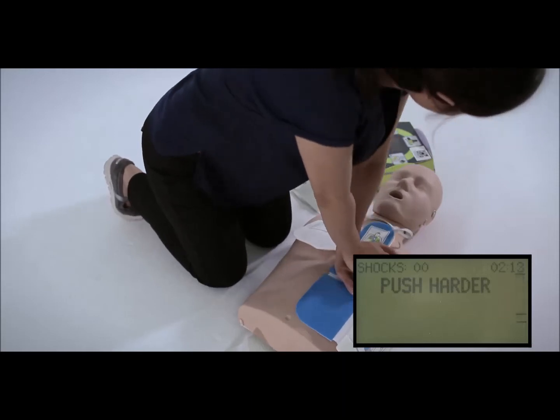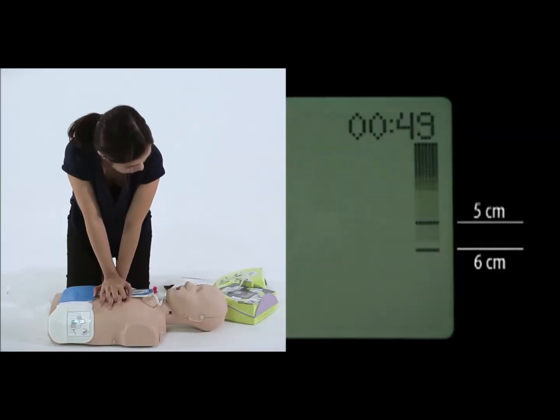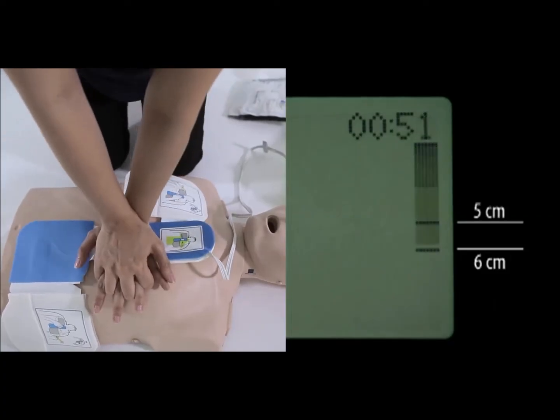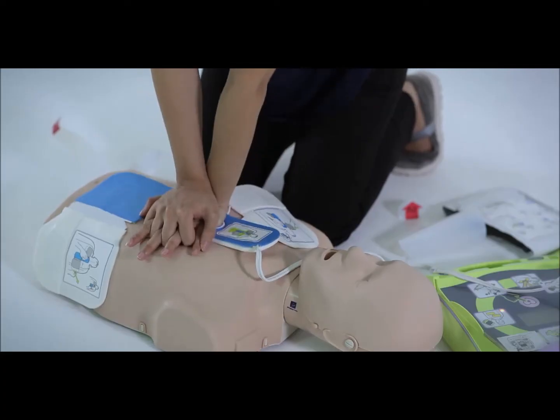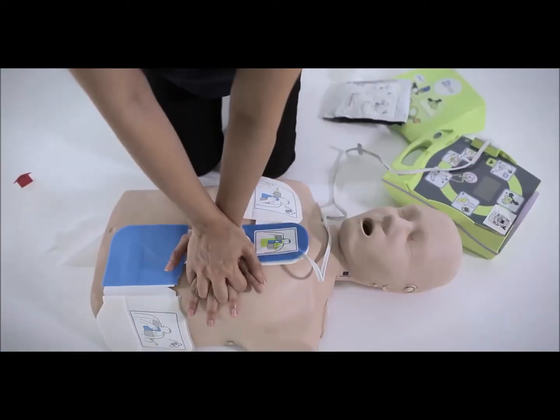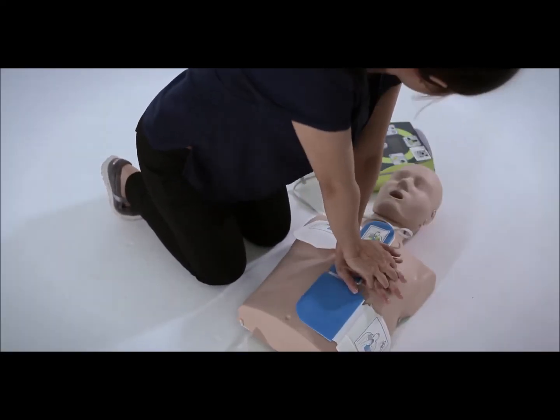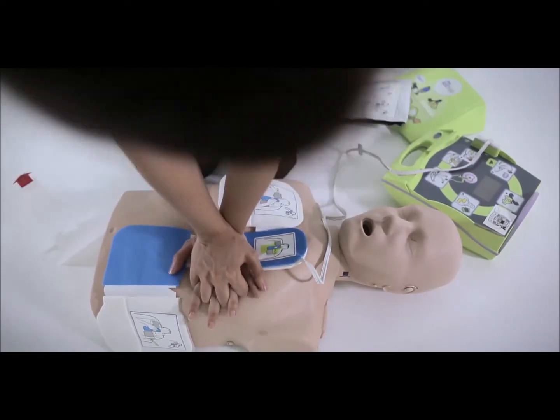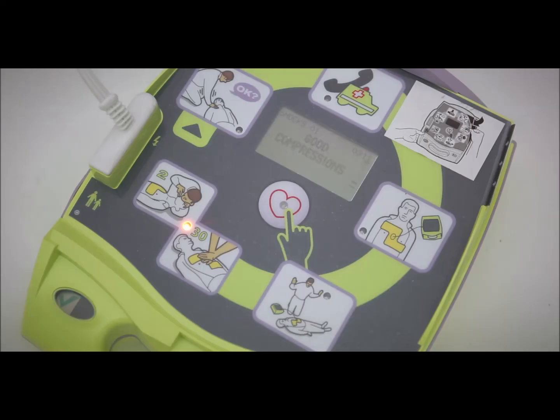Your chest compressions should be between 5 to 6 centimeters deep. These depths are represented by lines on the right-hand side of the LCD display, and the bar indicates the depth of each chest compression. If your compressions are less than 5 centimeters deep, the AED will prompt you to 'Push harder.' In this case, you will need to increase your compression depth. When you consistently achieve the correct depth, the AED will announce 'Good compression.'